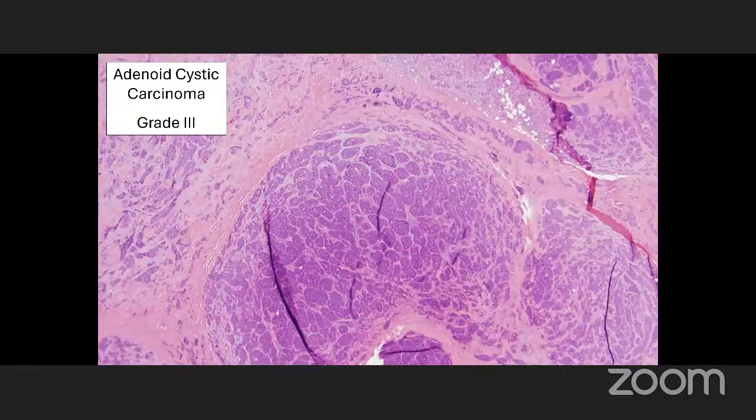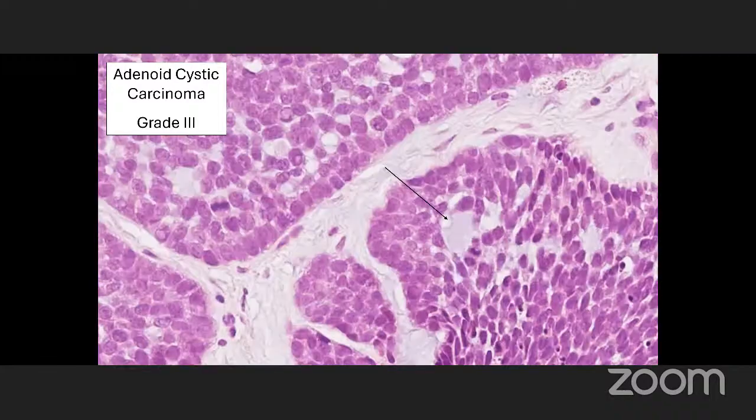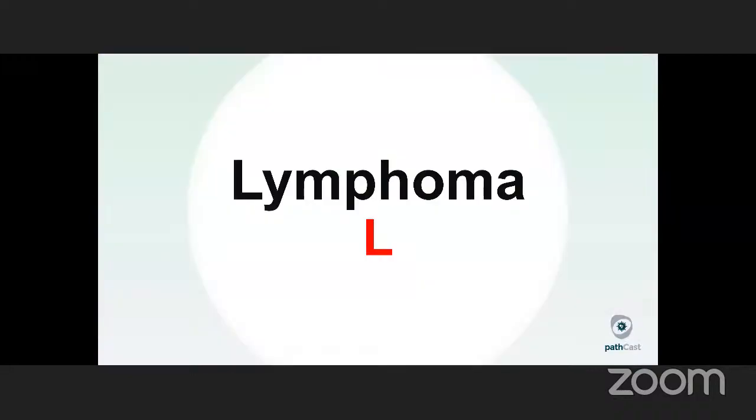Here's another example of solid adenoid cystic carcinoma with those very tight, dark, solid nests. And the way to recognize them as adenoid cystic is to look closely. Every once in a while in those presumably solid nests, you'll see a little bit of this basophilic material, okay, that is so characteristic. And sometimes you'll find better cribriform foci if you look around. But even if you don't, you often find this material in the mostly solid tumor, and that's a very good clue for adenoid cystic carcinoma.